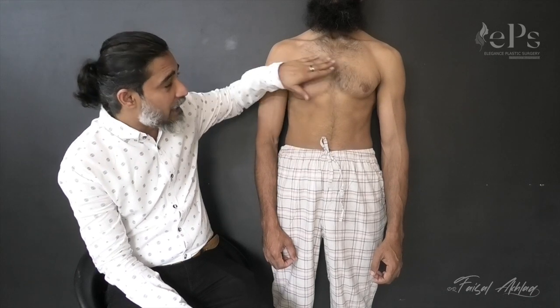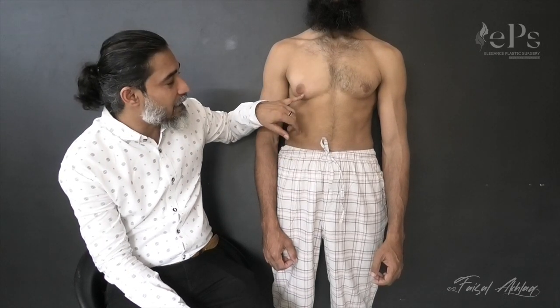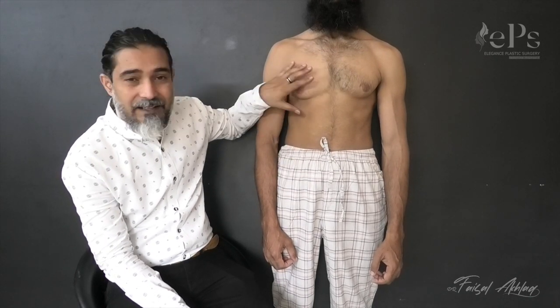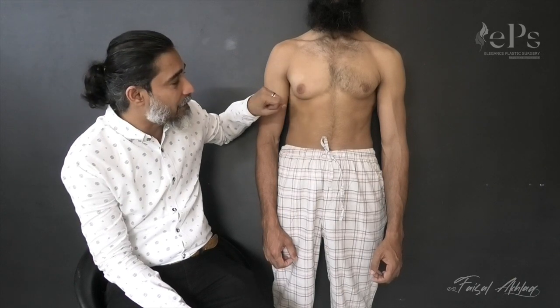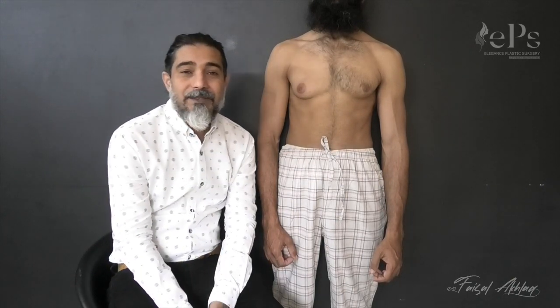So we don't need any liposuction. We have cut under local anesthesia and we will remove this gland.